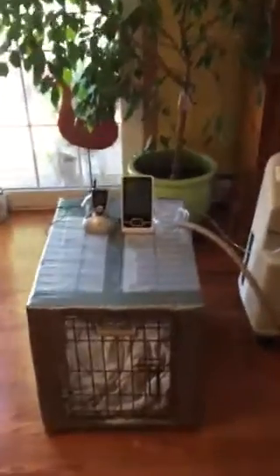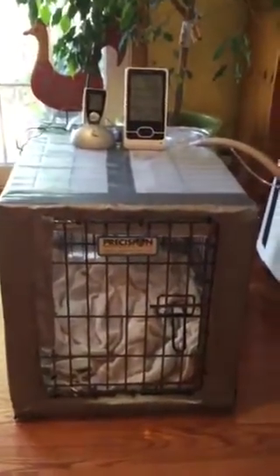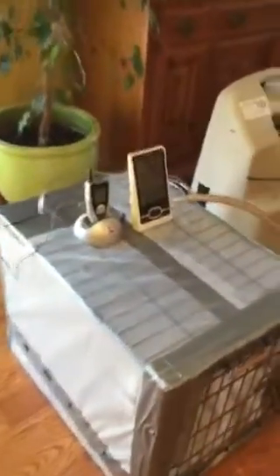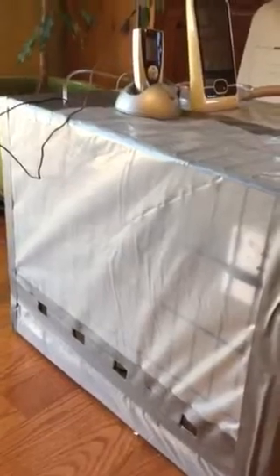Okay, this is my cage, and we took a standard metal cage that is foldable, and I wrapped the cage in a 4 mil plastic, and I pretty much wrapped it like a Christmas present. As you can see on the bottom, I had to give it some ventilation holes for carbon monoxide, and so I did that. I have 4 holes on each side.